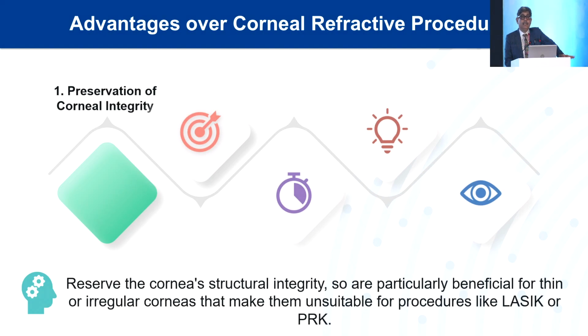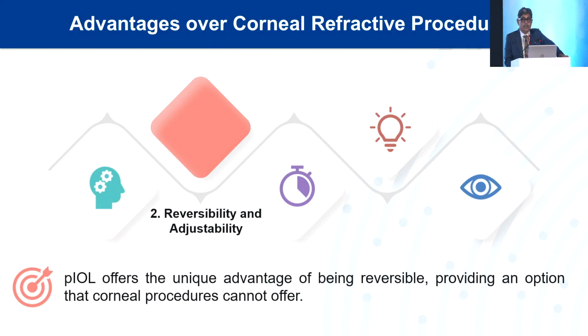The advantages of this over corneal refractive procedures are that it preserves the corneal integrity. Unlike corneal-based surgery, the structural integrity is maintained, and it is particularly beneficial for thin or irregular cornea, steep cornea, or chances of ectasia, which make them unsuitable for LASIK or surface corneal procedure. The other advantage is reversibility.